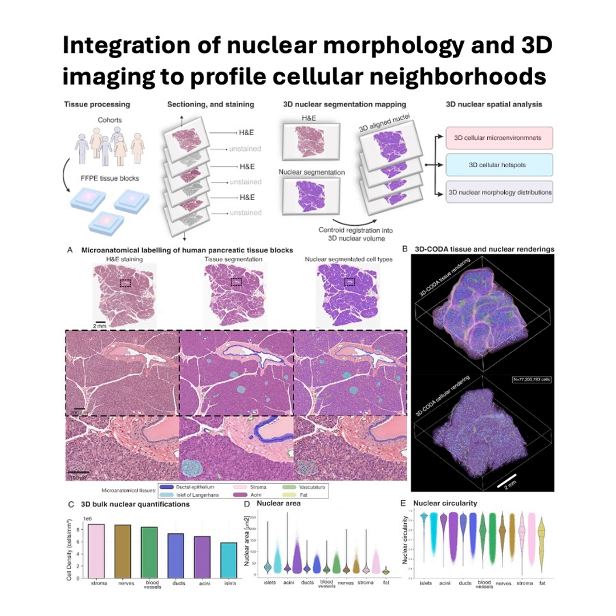So let's start with something fundamental. The cell's nucleus. We all learned in school it holds the DNA, but its physical characteristics, its shape and size, are actually incredibly revealing. That's right. We talk about nuclear morphology, which is basically the size, the shape, even the texture of a cell's nucleus. Like the cell's command center's appearance. Exactly. And it's a key storyteller.